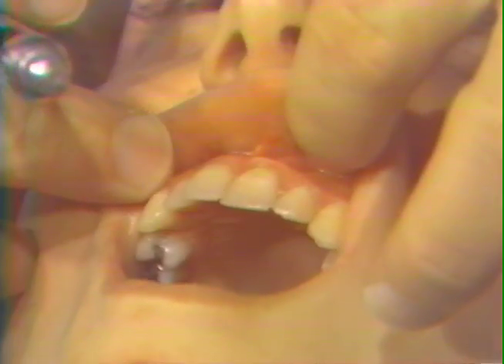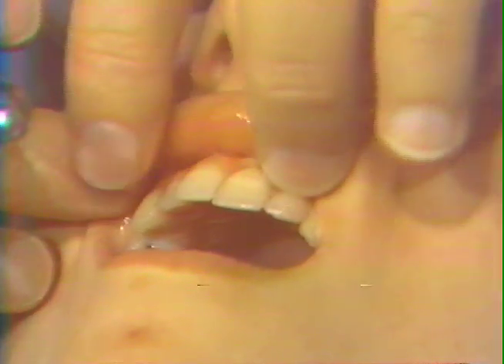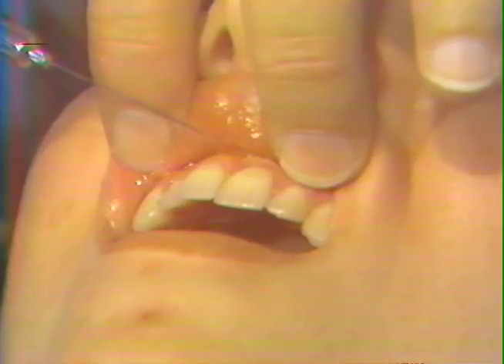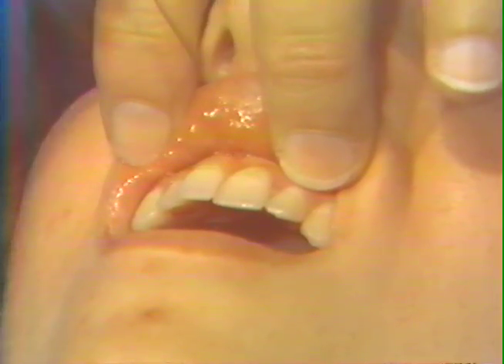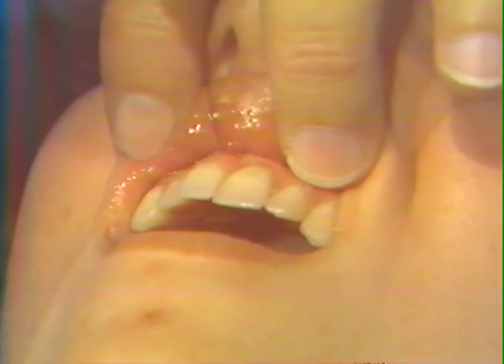The alternate approach is to proceed from the labial aspect, utilizing the interdental papilla, passing directly through the papilla to the area of the incisive canal opening on the lingual palatal surface.